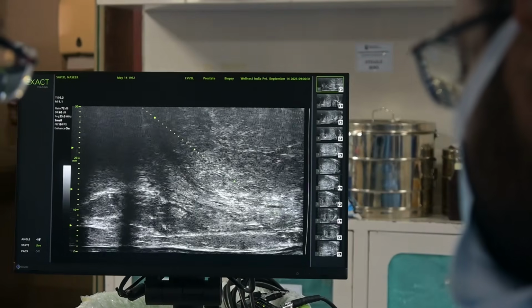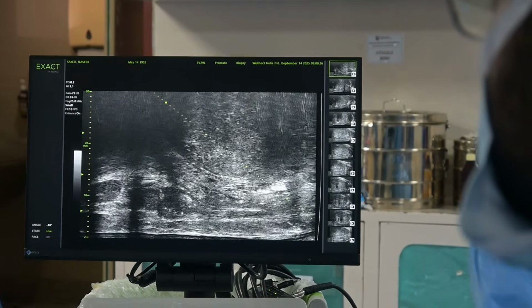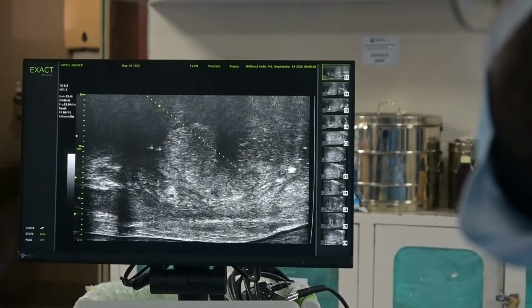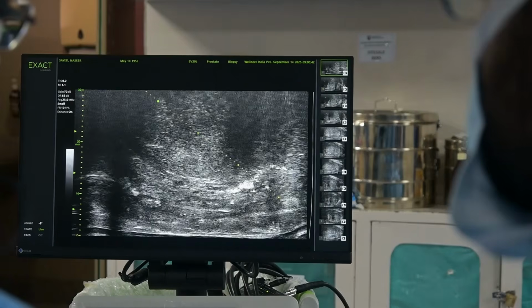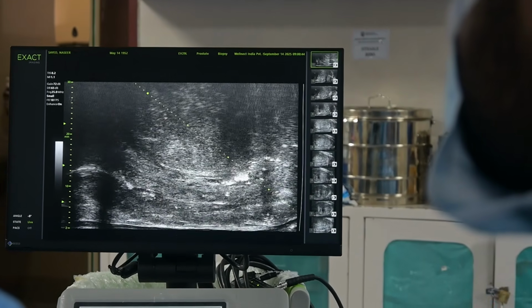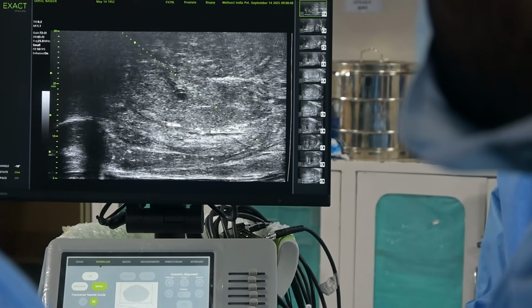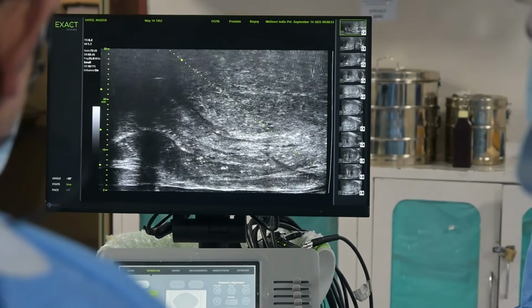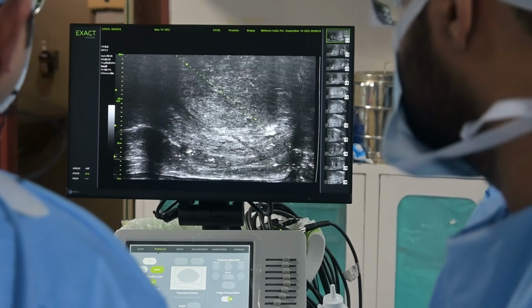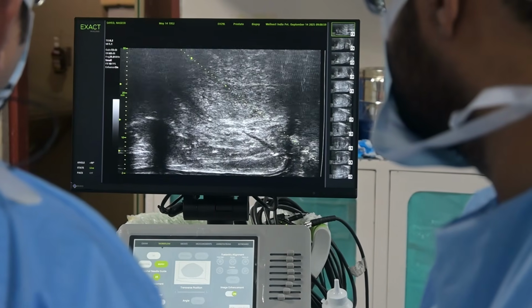So, sir, I showed you when I took targeted biopsies, I showed you a lesion which was PRIMUS 3. In my mind, that is benign, but that calcification that I saw earlier, I took a target from that. In this, the calcification is called the starry sky appearance, which corresponds to a PRIMUS 4 lesion. That was at the apex.